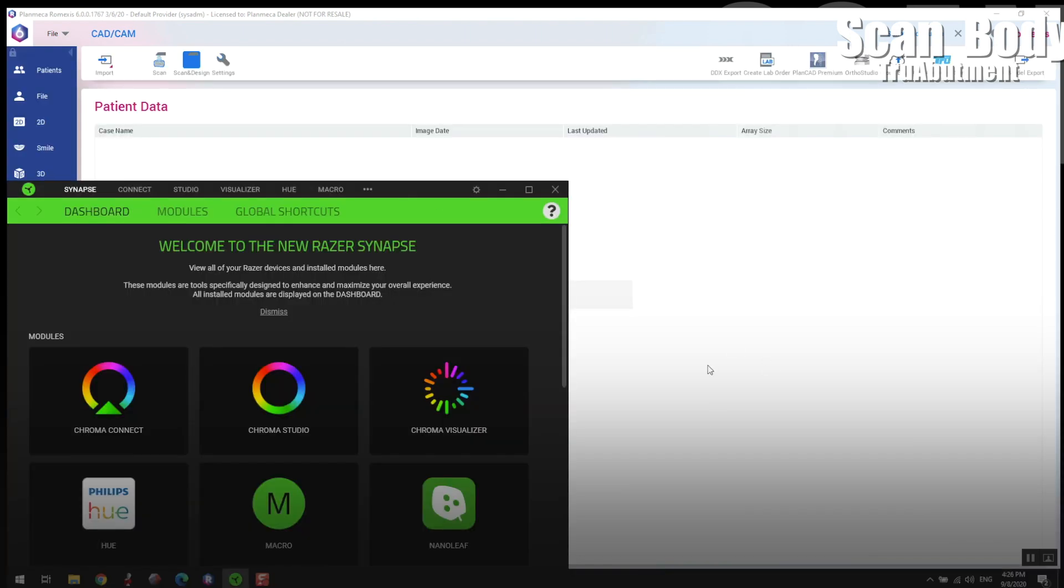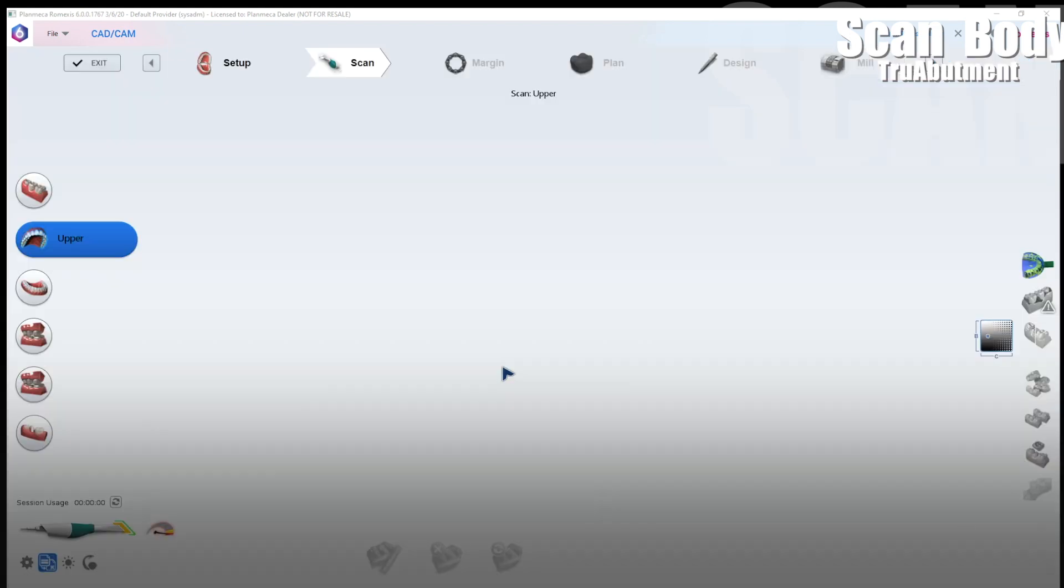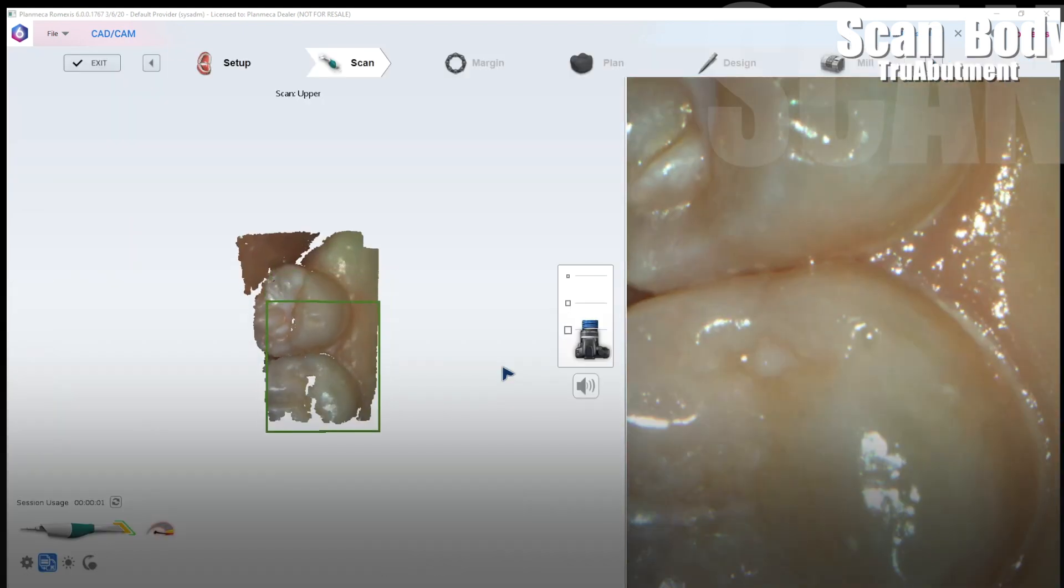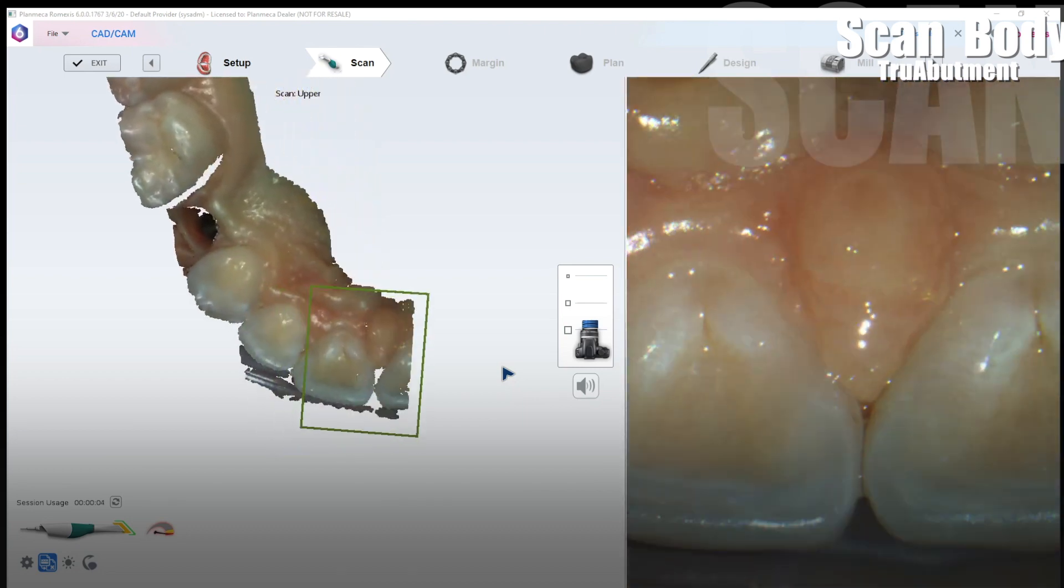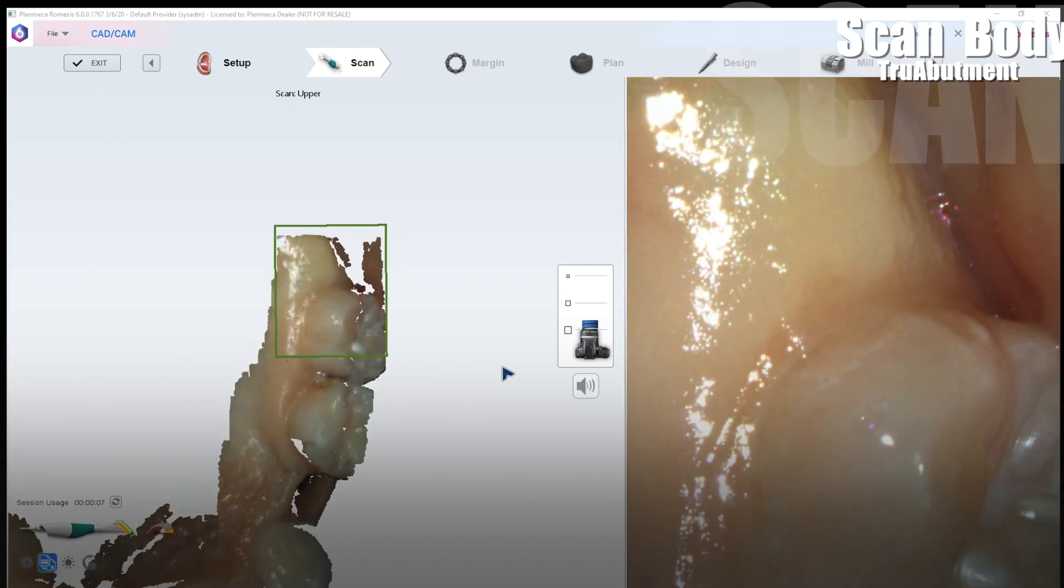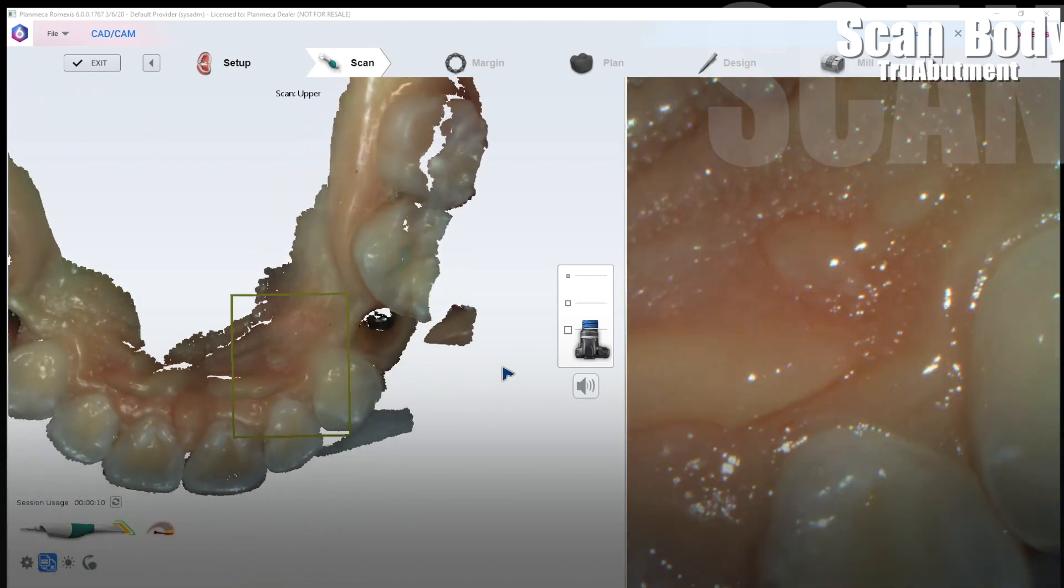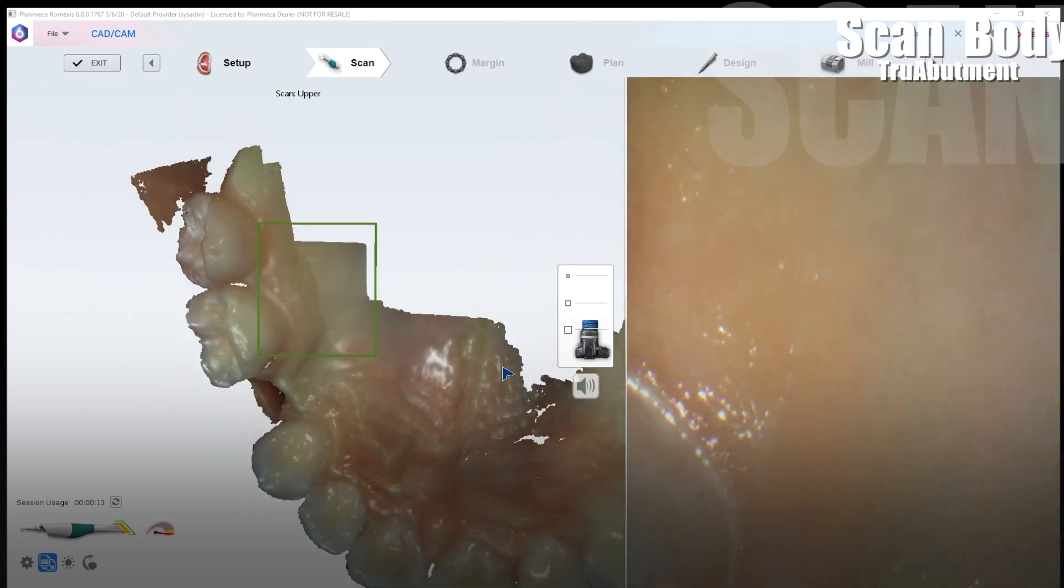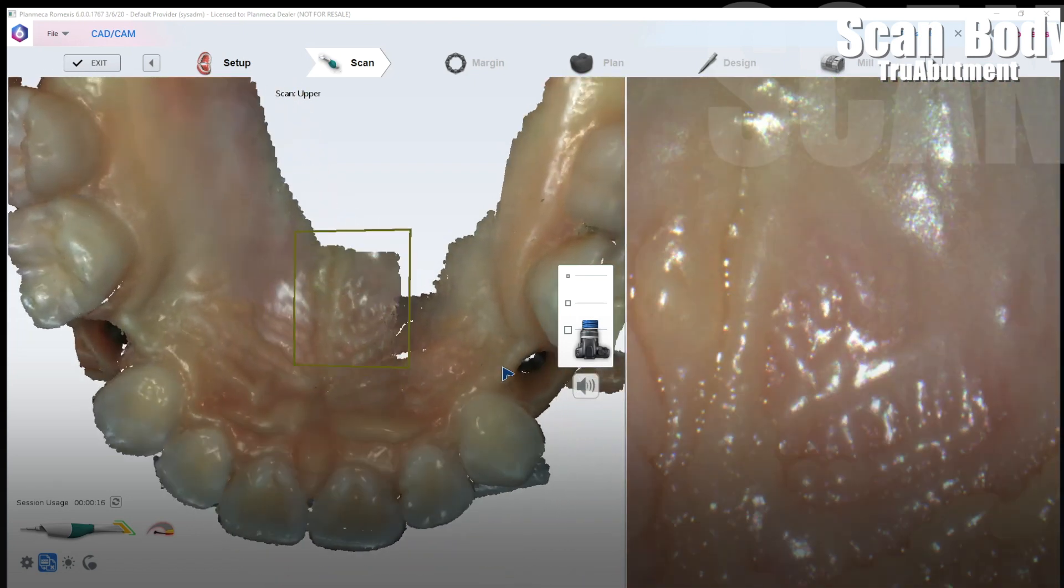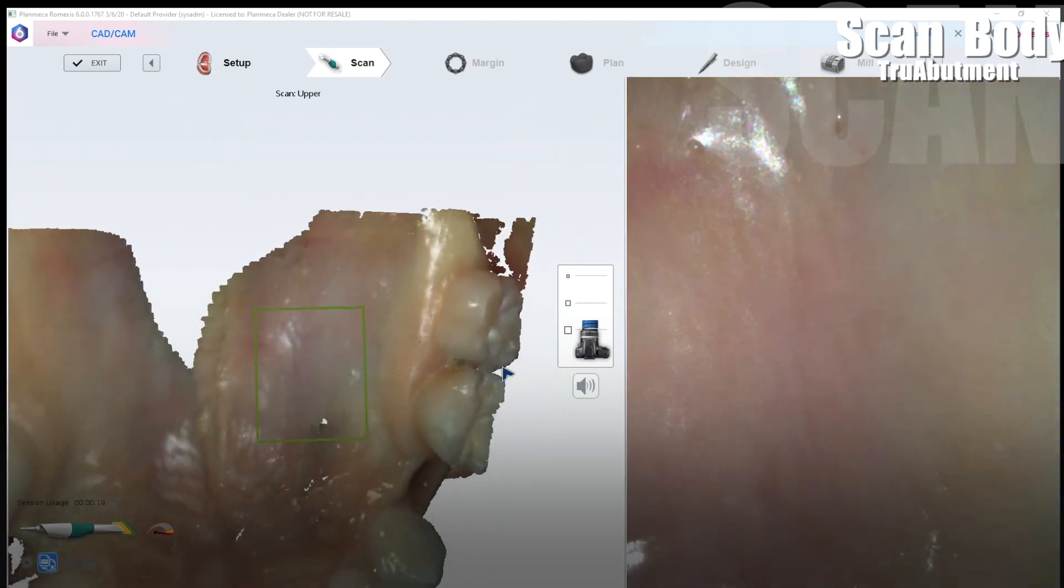Okay so let's slow down a little bit. Let's go ahead and actually do a whole case start to finish. So here's a different case. The first thing that you do is unscrew your healing abutments and take a complete arch scan. I typically like to start scanning on the lingual of the maxillary like this with the Emerald or Emerald S. I'm gonna go ahead and fill in all of this data and capture the palate and everything like that.